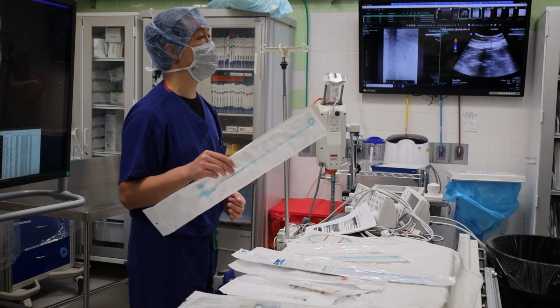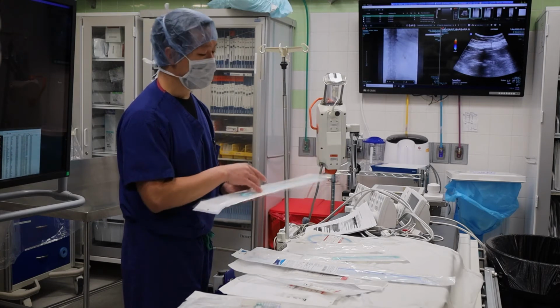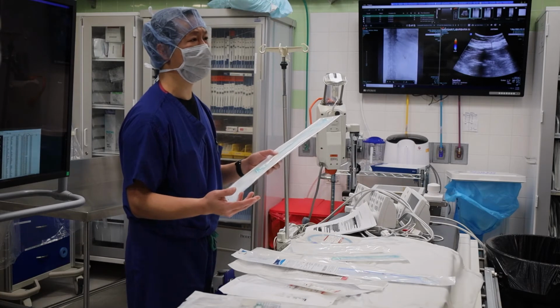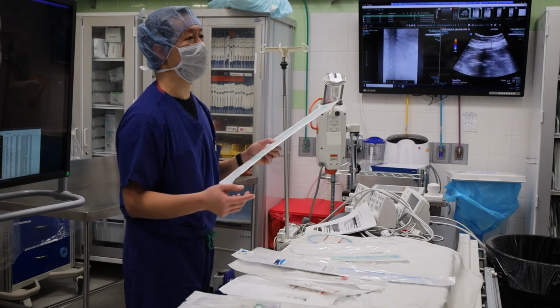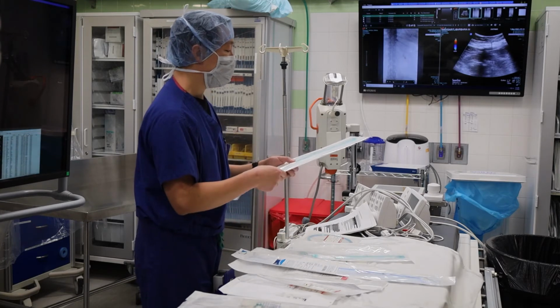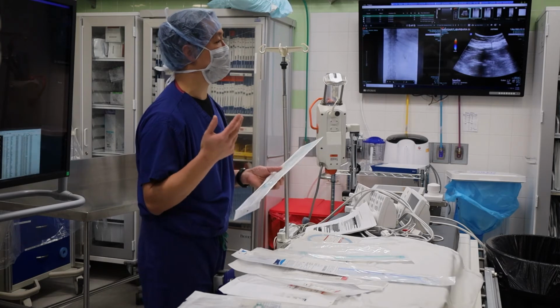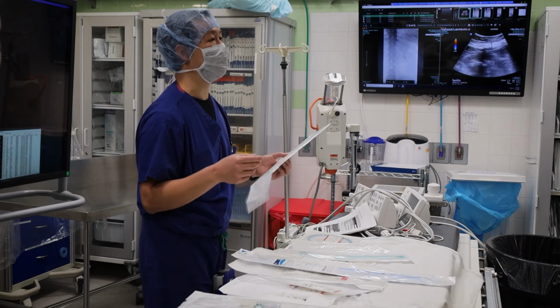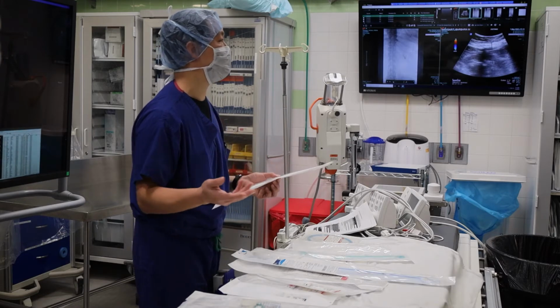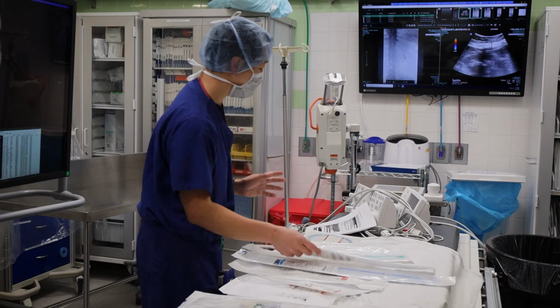The patients that you guys have seen that have like the 14 pigtail in their back, the reason why they have a 14 pigtail is because I don't think we've got 14 Nephs. Do we actually have 14 Nephs? I don't think we do. I think for her, we actually put in a pigtail. Some people just make so many stones and crystals, they clog up a 10 all the time, and because she flies down from another state, we put in larger tubes for her. But that's not typical, and you should not treat that as a typical case.